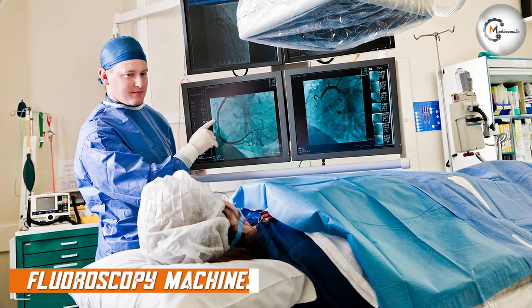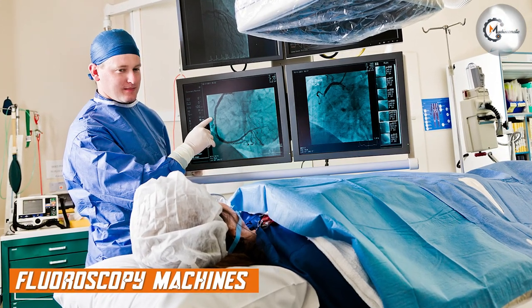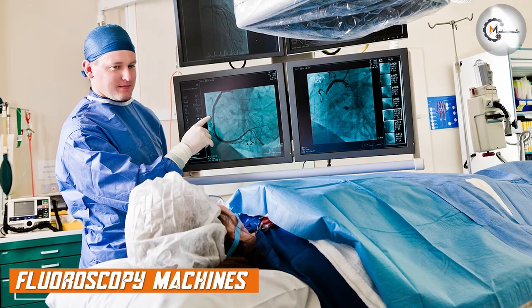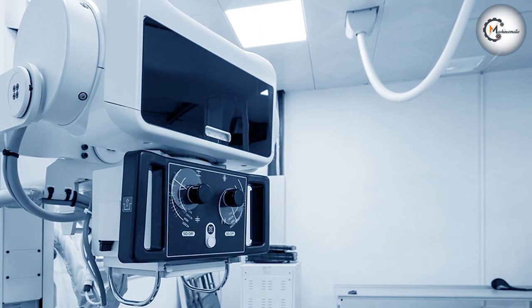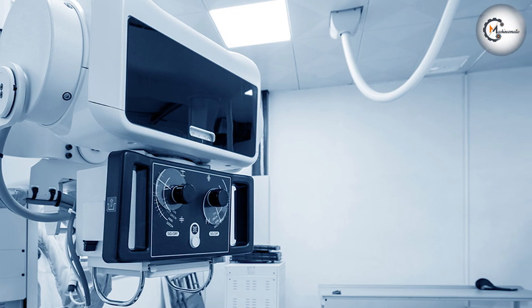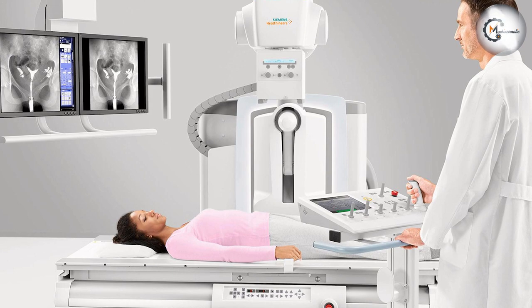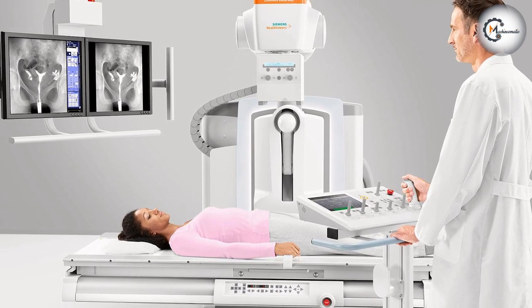Fluoroscopy machines use x-ray technology to create real-time images of the inside of the body. Unlike traditional x-rays, which produce still images, fluoroscopy machines create a continuous stream of images that can be viewed on a monitor. This allows doctors to see how different parts of the body move and function in real-time.